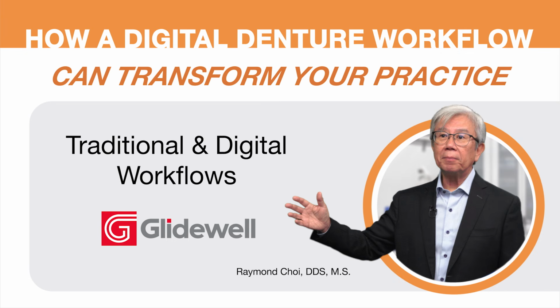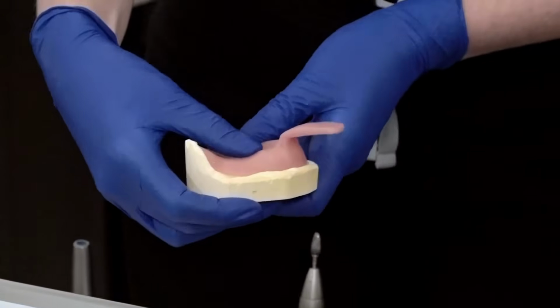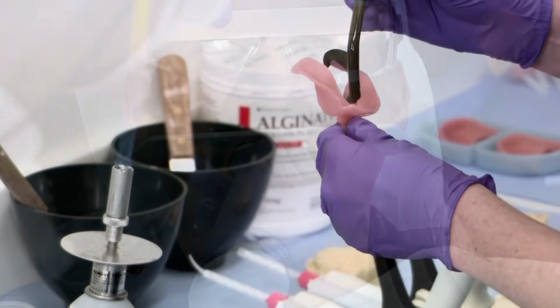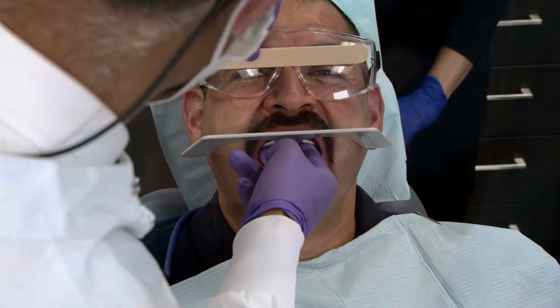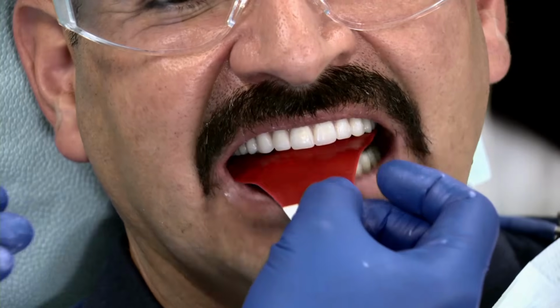The traditional workflow, everyone knows already. We take the preliminary impression, make a custom tray, take the final impression, border mold. That's a second visit. The third visit, you do a jaw record, vertical dimension, fourth visit, wax try-in. Fifth visit is the delivery, and that's not including the post-op adjustment potentially, right?